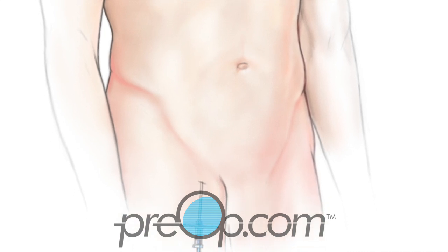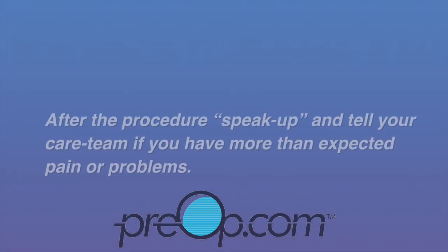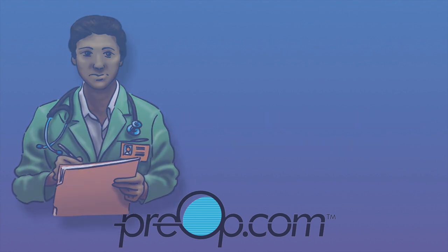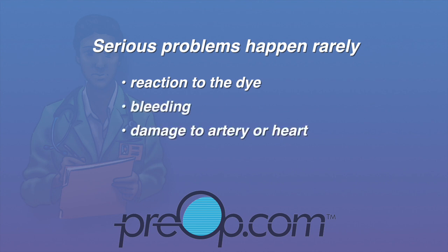After all the necessary pictures have been taken, the catheter is carefully removed from the artery. Gentle pressure, a stitch, a patch, or a plug is used to prevent bleeding from the artery. The incision is covered with a dressing. After the procedure, speak up and tell your care team if you have more than expected pain or problems. Serious problems can happen but rarely — there is a risk of reaction to the dye, bleeding, damage to an artery or the heart, stroke, heart attack, and even death.